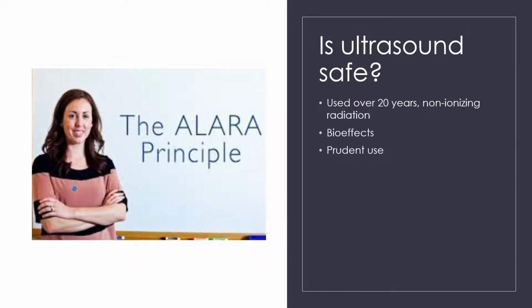So is ultrasound safe? This is a question that has been asked ever since we've been using ultrasound to image. It has been used for more than 20 years. It is non-ionizing radiation, which means, the ionizing radiation is what's used in x-rays. So the ionizing radiation can produce harmful effects, but there are no proven bioeffects using ultrasound, over the more than 20 years that it's been used.